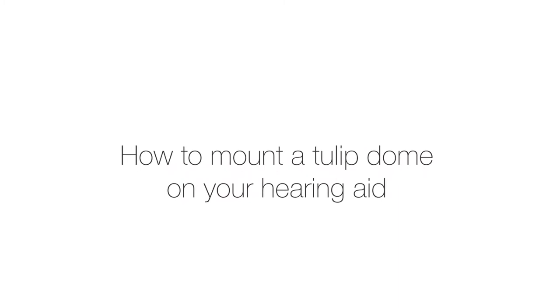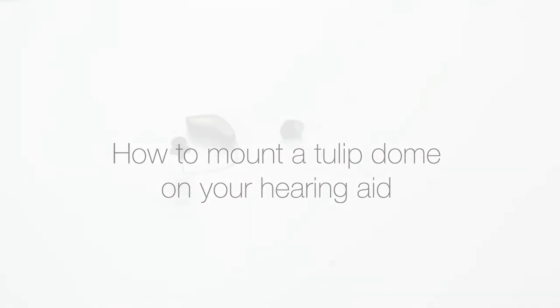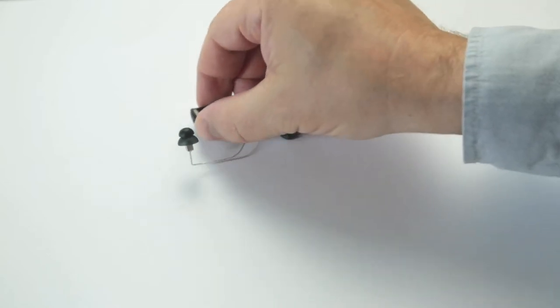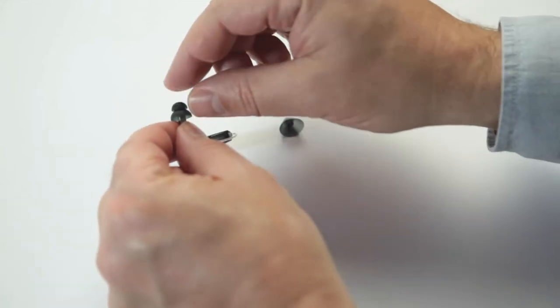How to mount a tulip dome on your hearing aid. Start by removing the existing dome by slowly pulling it from the hearing aid receiver in a controlled motion.